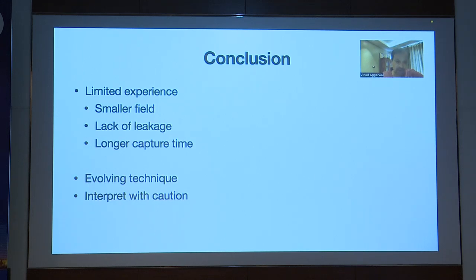So basically, OCTA is an evolving technique. It is very promising, but it has several disadvantages as of now, and I'm sure as we progress with time, the technology will become better and we will be more apt at interpreting this particular technology. As of now, I would just mention that single caution that you have to interpret each and every image with caution. And before you make a decision based on OCTA, please sit on the machine and go through all the OCT scans as well as the OCTA B scans to decide the future course.